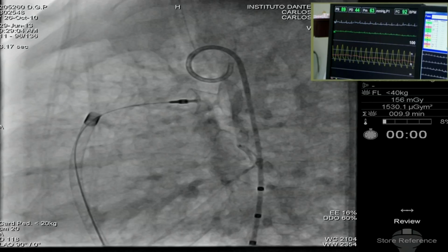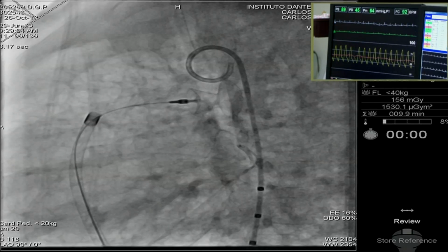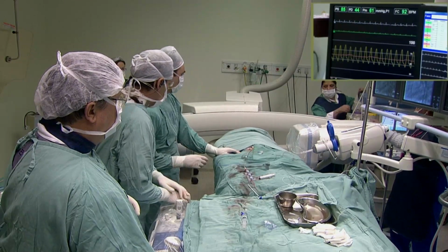Carlos, is it possible to rotate the pigtail, and maybe with this rotation of the pigtail, you get a better configuration of the device? So, Carlos, rotation of the pigtail. Why would we have a better configuration of the device? Yes, because you push this part to the side, and when you look at the box, you don't see it bulky.